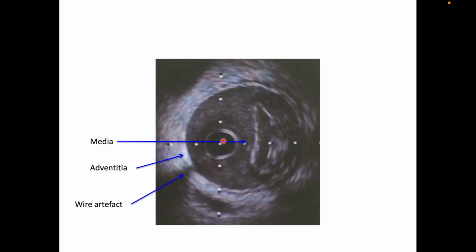Then in that case, this white line should be intima. And intima usually comes all around. So if you see, this intima is here and it is going all around like this, and in between should be the true lumen then. So where the IVUS catheter right now is, this is actually the false lumen. This is the media, which is so big because of the blood collection in it, because of the hematoma in it. And this on the other hand is the true lumen.